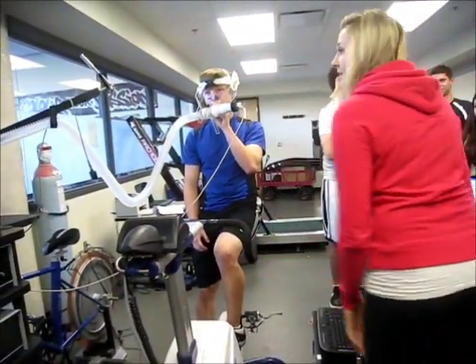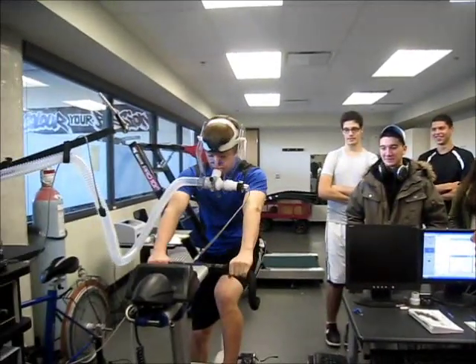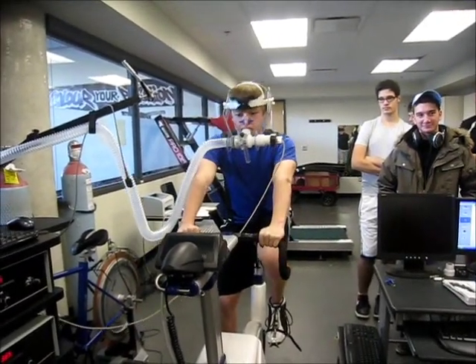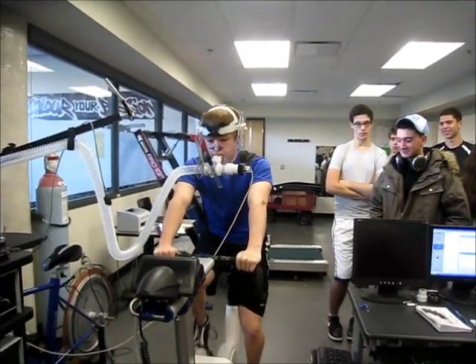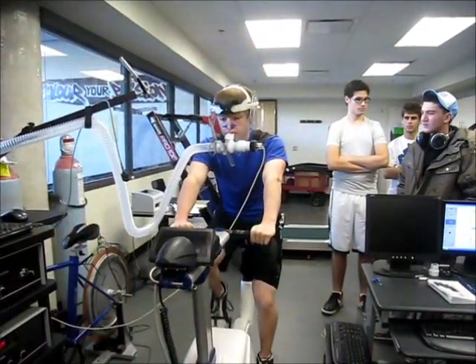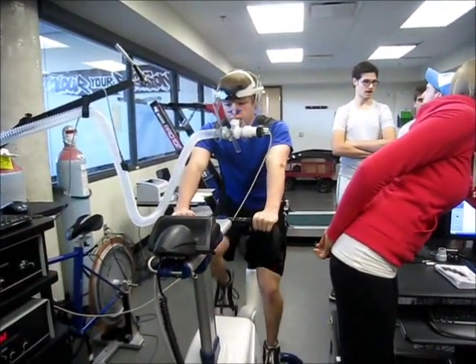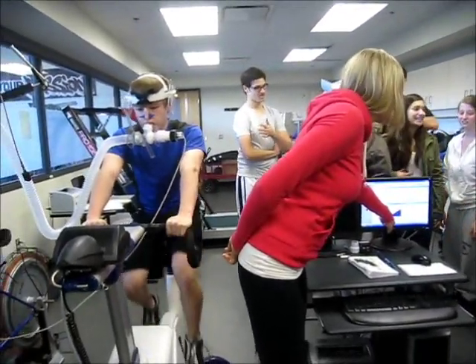Sounds good. Let me know when you're ready. Better not embarrass us — you're a top athlete. So you can start cycling whenever you're ready. I started the test. There's 50 watts resistance on there. You can watch on this computer here. This is the time of the test — so it's a 2-minute mark when it'll go up. This is RPM, revolutions per minute. And this is the load of resistance on the bike.